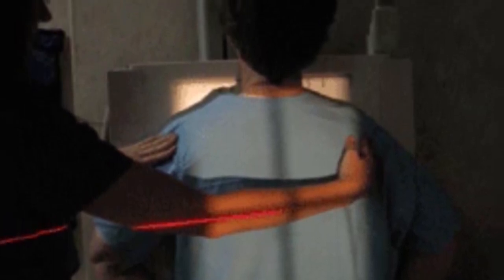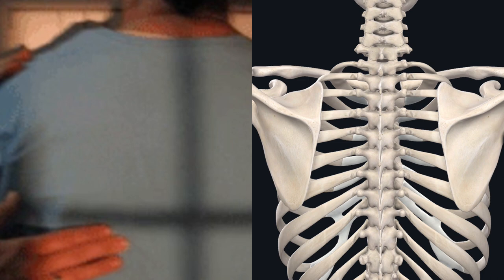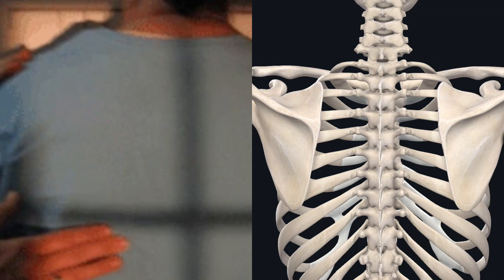Gently roll the patient's shoulders forward so that their anterior surfaces touch the vertical grid device. This motion rotates the scapulae laterally and out of the lateral lung fields. Instruct the patient to raise the chin enough to rest it on the vertical grid device. Check to be sure that the patient is looking straight ahead to avoid rotation of the shoulders. Align the collimated field to enter the patient at the mid-sagittal plane at the level of T7, located by palpating the inferior angle of the scapula.